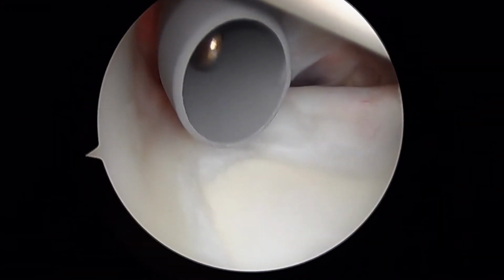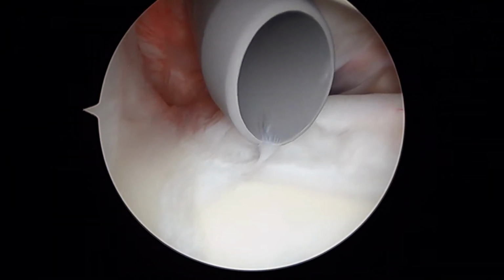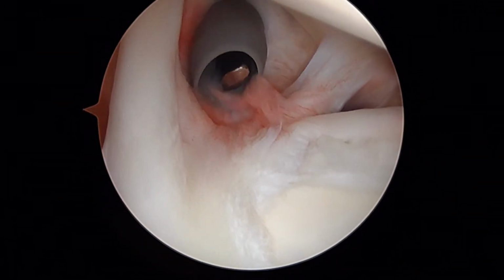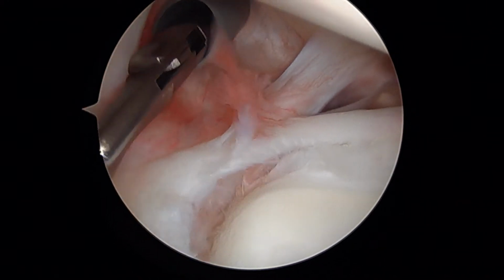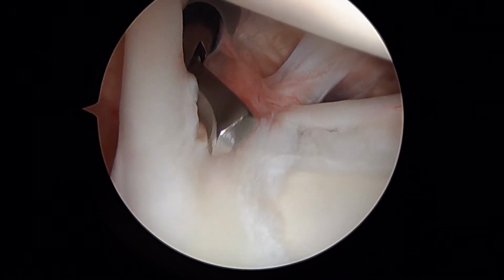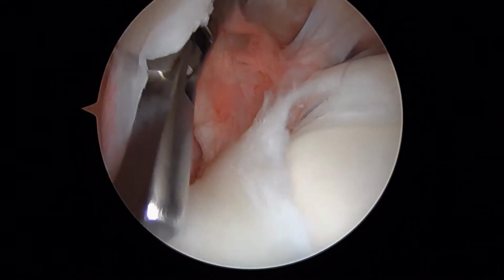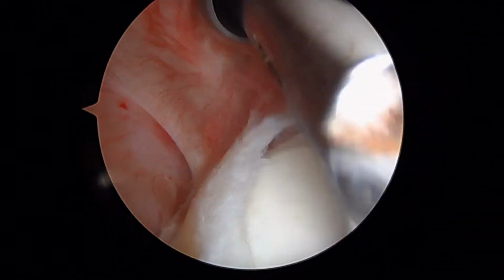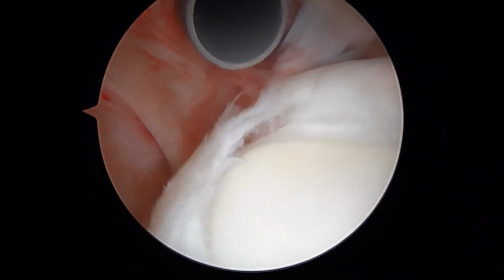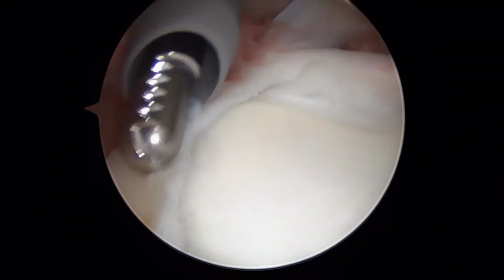So we're going to go ahead and take a pair of arthroscopic scissors right now and release this biceps tendon as the first step in our tenodesis. We're going to release it right at the base. And as we go ahead and cut across, very quickly, you'll see how that biceps is now gone. So now that can no longer pull on the labrum there. That takes care of that problem. We're going to use our shaver here just to smooth out some of the tissue that's left.